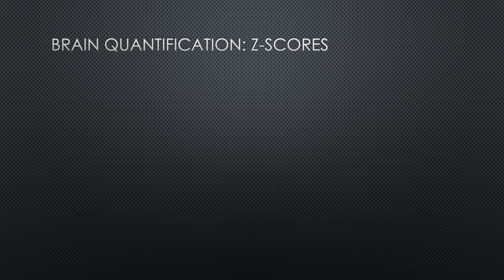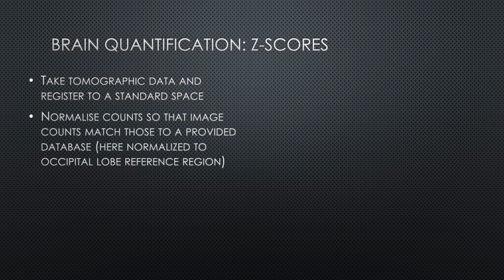The final quantification output I want to go through, and something that's used quite heavily in neurological imaging, is the Z-score. So what is the Z-score? What we tend to do is we will take our 3D data set and spatially register it to a standard space, to a template. So we can normalize the counts so the image counts match those provided in the template.